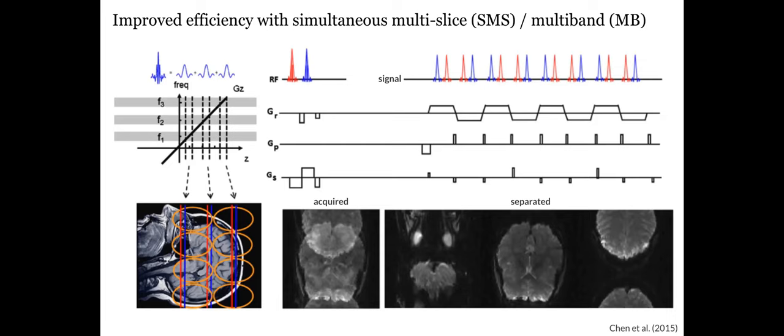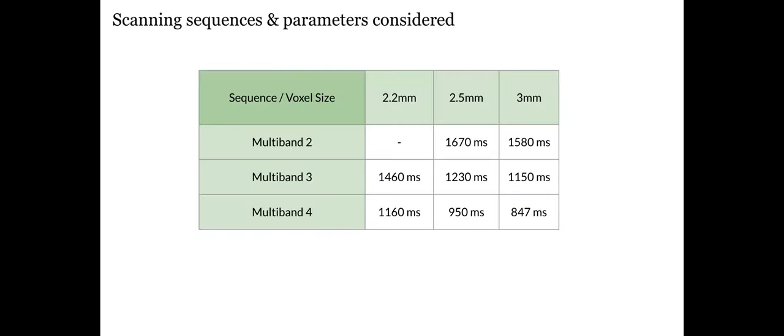So was the temporal resolution that was acquired the same for all the multibands? I believe they were all different. Here, the scan times for higher multiband were significantly shorter. The temporal resolution, you're saying. But did you perform any temporal averaging or temporal filtering? Because without that, you cannot gain that SNR. So before computing the metrics, we did resampling.